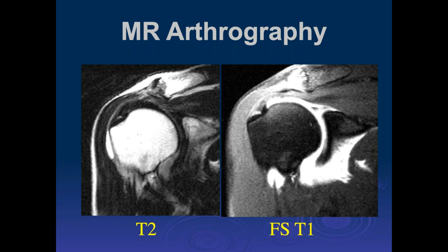On the T2 image there's no full thickness tear of the supraspinatus, but on the post-contrast arthrogram image there's increased signal along the articular surface of the supraspinatus — a high grade articular surface tear. There's also fluid in the subdeltoid bursa, which is very bright on T2. The contrast isn't as bright for reasons discussed. This is not communicating with the joint space since we don't see contrast in the bursa on fat sat, but we do see this partial tear of the supraspinatus insertion and likely a SLAP tear in the superior labrum.